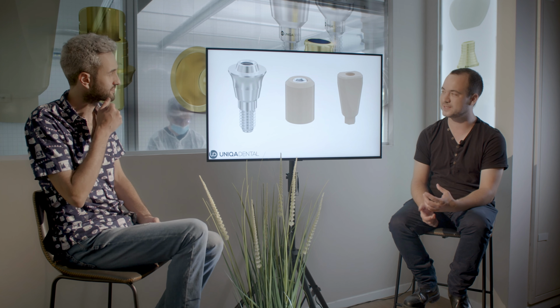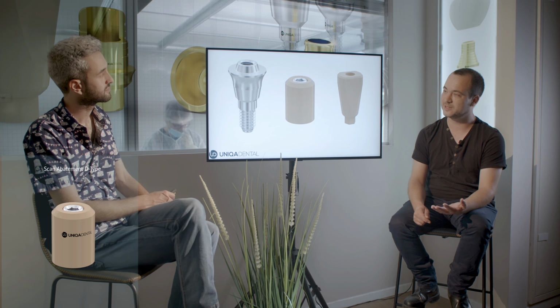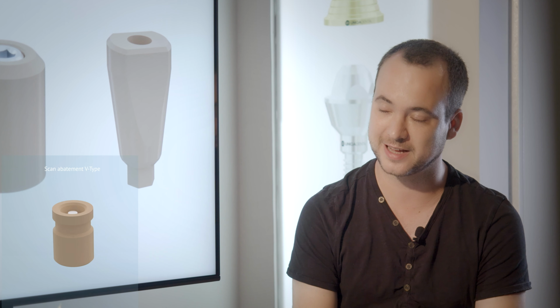When you take an impression with a scan abutment, you know the place of the scan abutment. When you know the place of the scan abutment, you know the place of all the parts below the scan abutment, the multi-unit and the implant. If you know what type of multi-unit you took, and what height of the multi-unit you took, you know the height between the scan abutment and the implant.